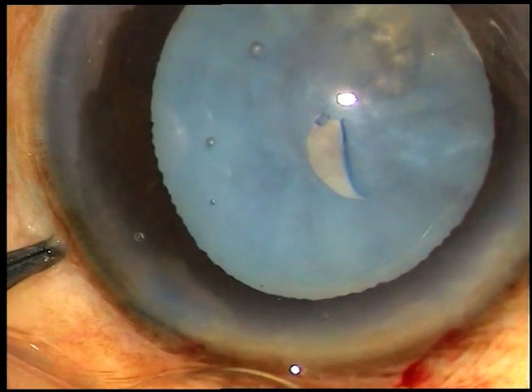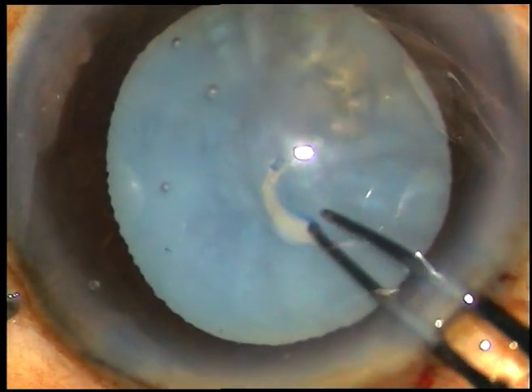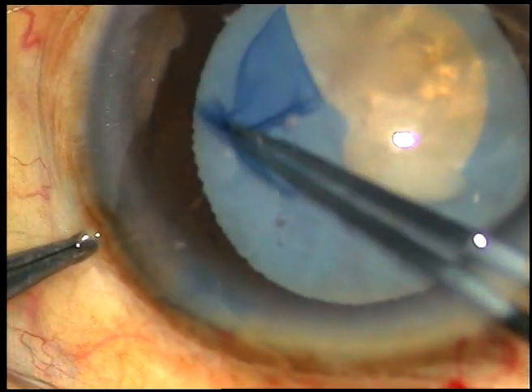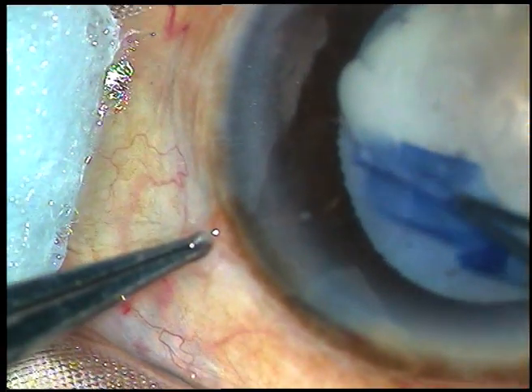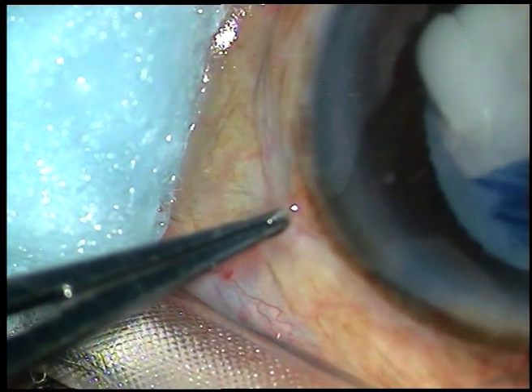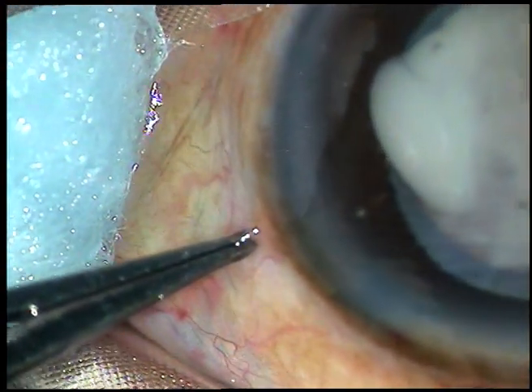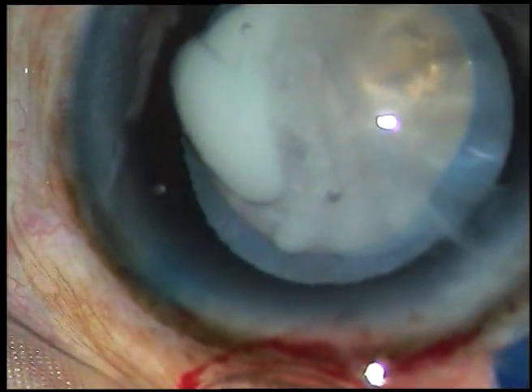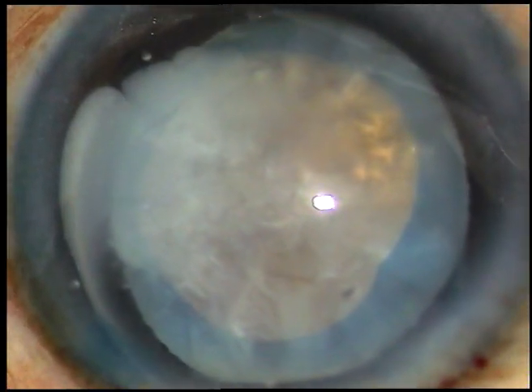Now I am going to do capsulorhexis. A capsular tag has been created. The cortex has degenerated and it has turned into a milky fluid here at around 3 o'clock — you can see that the milky fluid is coming out. Rhexis is done. I expected a hard nucleus in this case, so I have done a slightly larger rhexis. It is not very large; it is an adequate size rhexis.